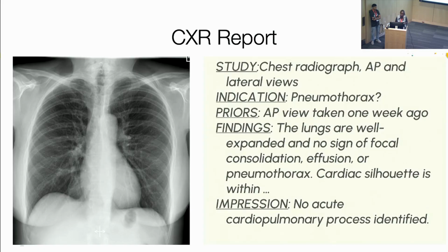But the challenge with that, right? Then in the morning, you have this thing called an overread. I think you should explain this better than me. Yeah, so you have this thing called an overread that is now the final report. Reports have different statuses, and for us now, I do believe we have access to the database that can give you those types of reports. But remember, that data may not exist in your enterprise. When I asked Chad to pull that data, he would never be able to pull it. I would have to get it from another database, the voice recognition database, if it's keeping snapshots of that information. So you can imagine amazing ways, when we start to think how LLMs could help with education, or this teacher-student form of training, to say here is how the learning process works for radiology, and this is how you can use it to train an AI model.